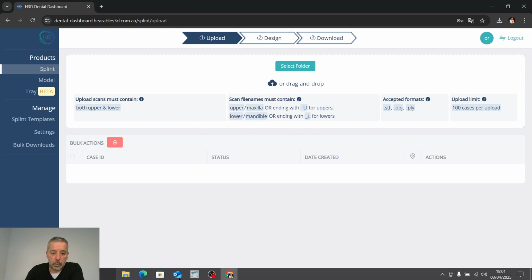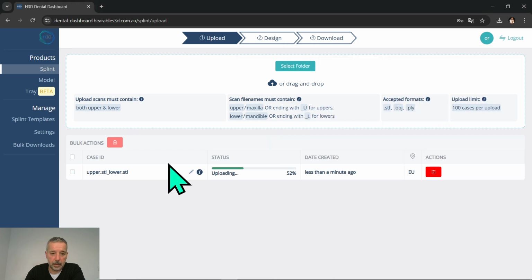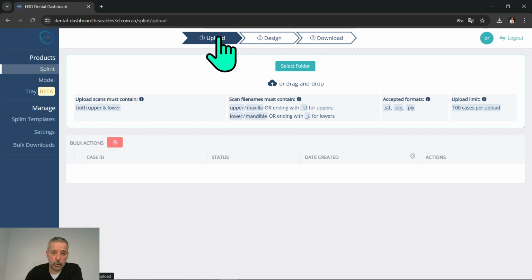Finally, you select the two STL files and put them here, and look, the machine eats everything, and the upload is finished. You have the chance to upload others again, and when the upload is complete, all the files come here, to design.